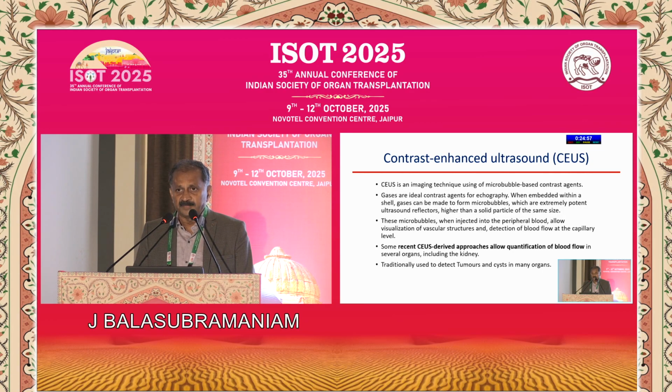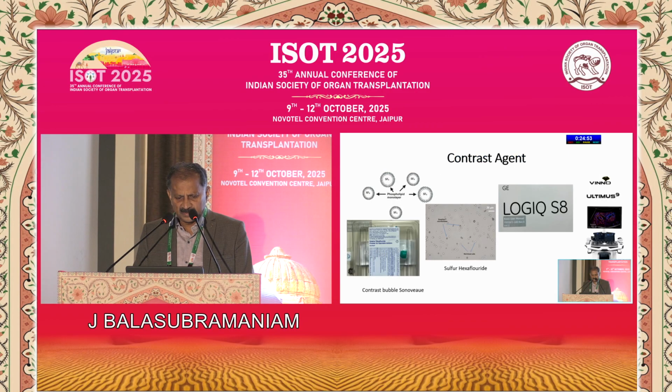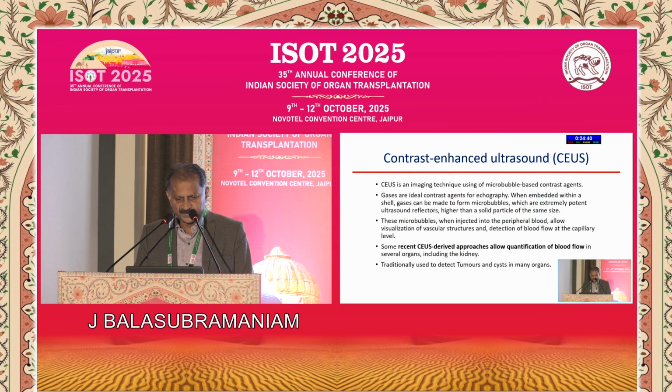I'll be telling you about the bubbles, not in detail. Actually, a phospholipid monolayer is there, and inside we have these gases. It is often sulfur hexafluoride, and many of these machines have this capacity, but they are not much used.